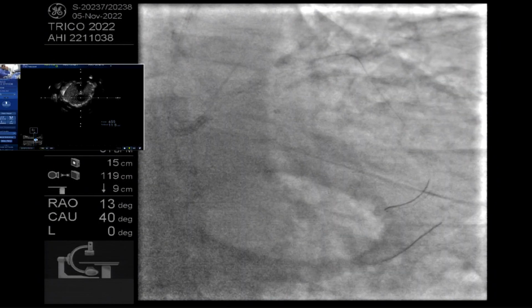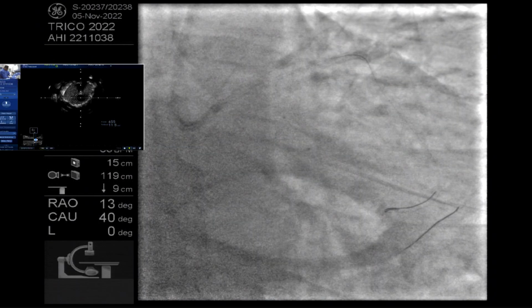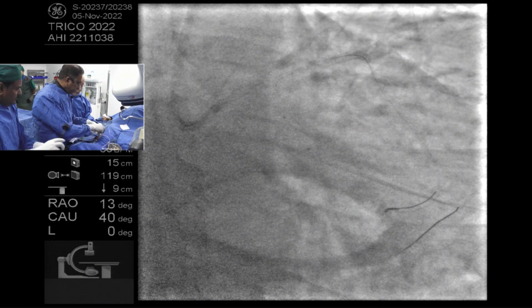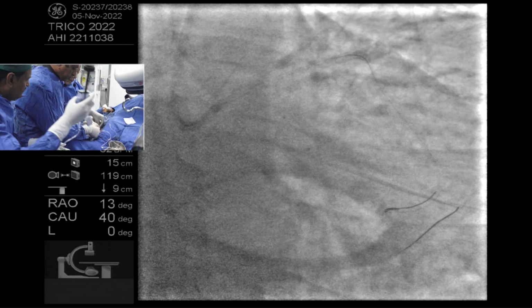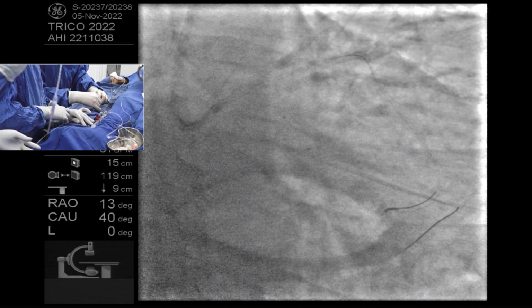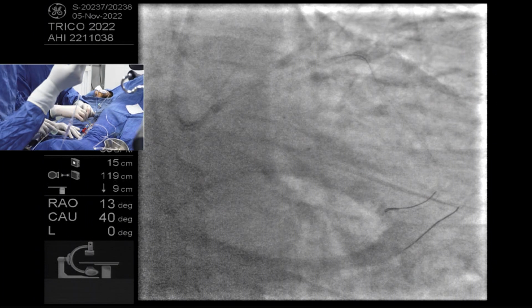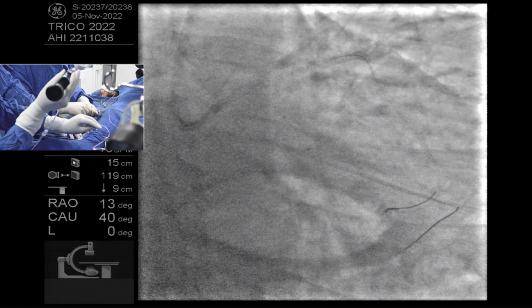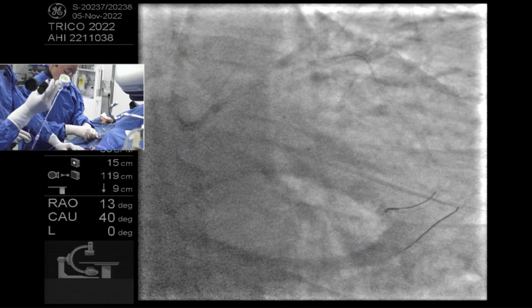Does everyone on the panel feel the same? I've got to say, I probably would not. I would probably leave it if it looked perfect, but I'm always questioning that decision. I agree with you both. That's why I come back to my question: since I started using OCT instead of IVUS, where you see the struts and the whole geography, you sometimes realize that you don't have much in front to leave, and that the wire will cross anyway, even if you have to re-intervene.